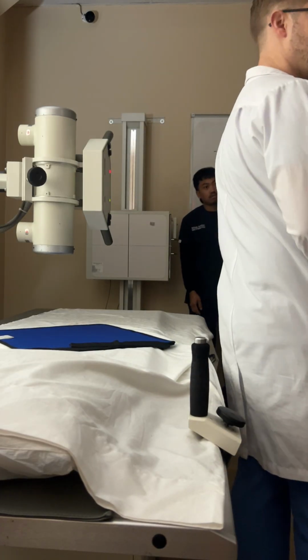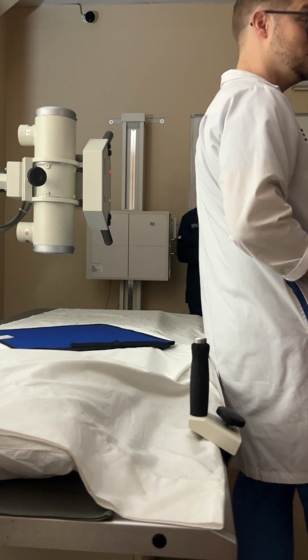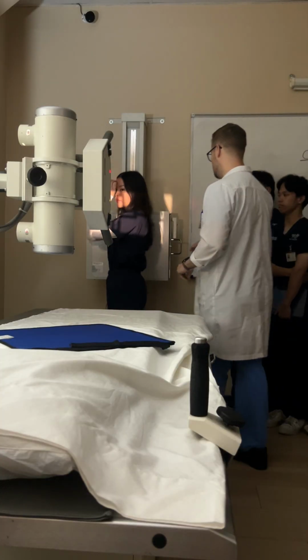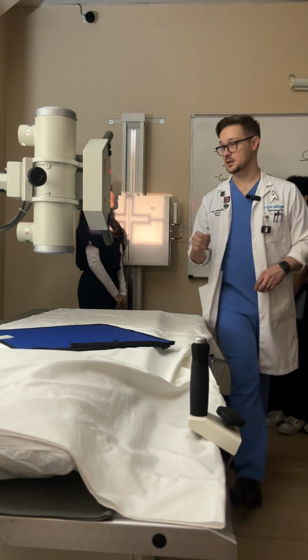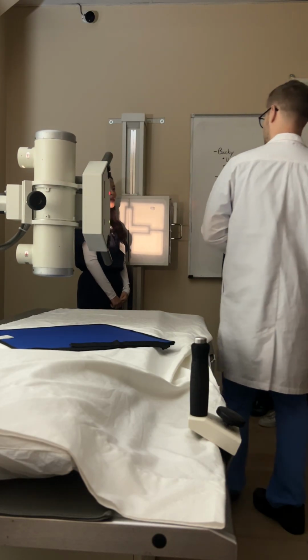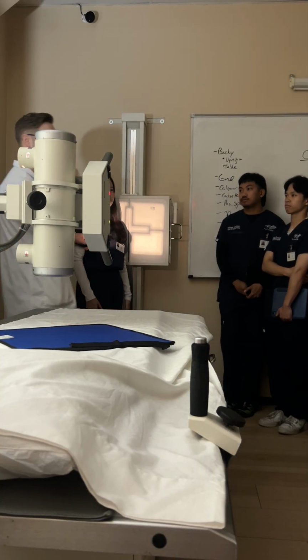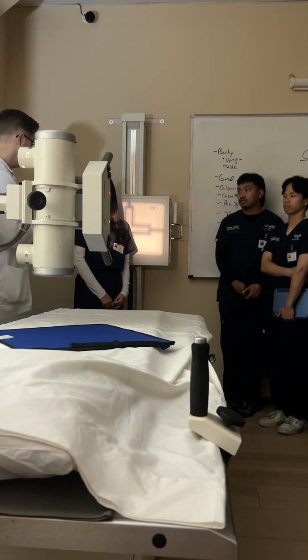Let me have a mock patient. Who wants to be my mock patient? A lot of hands. Whoever's closest. Come on over. All right, so first thing I'm going to do. Hi, can you tell me your name and your date of birth? Excellent. Do you know what we're doing today? No. Great. I'm going to do 2 quick pictures of your chest, okay? I've already had her change. She's not wearing a bra. She's wearing a gown.